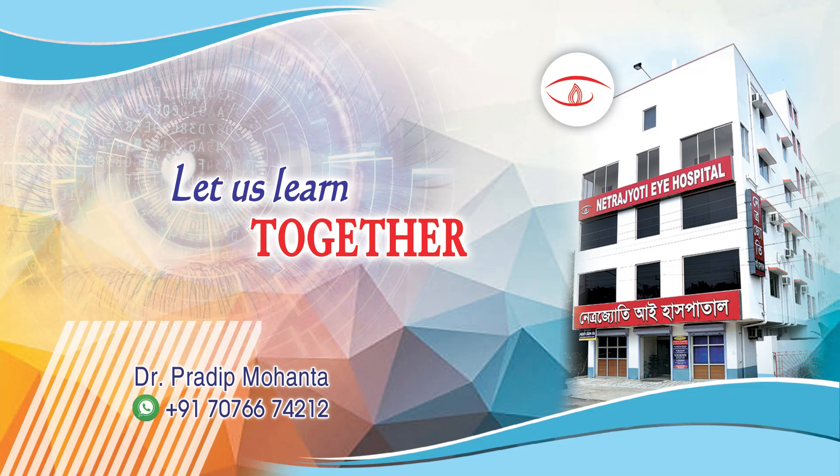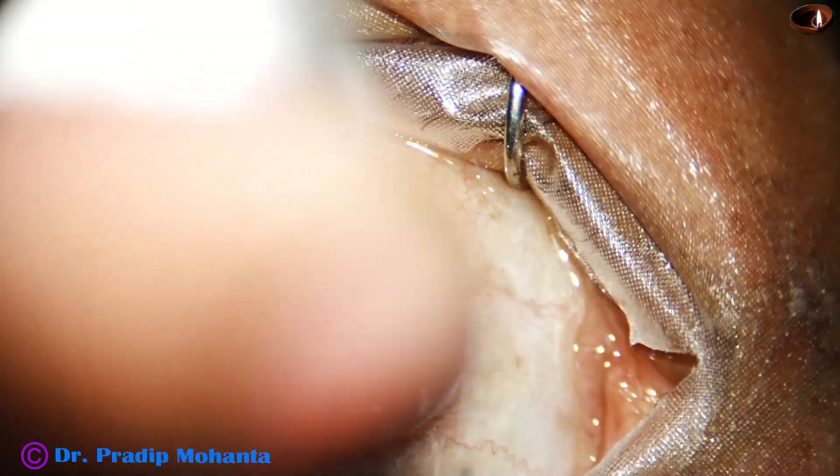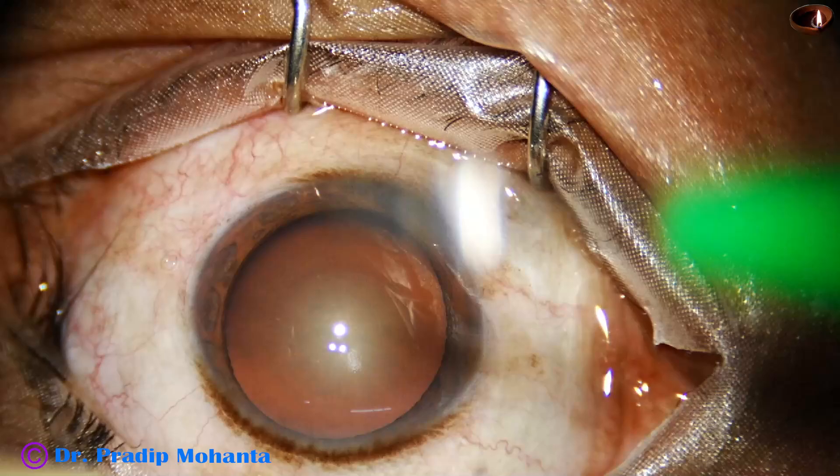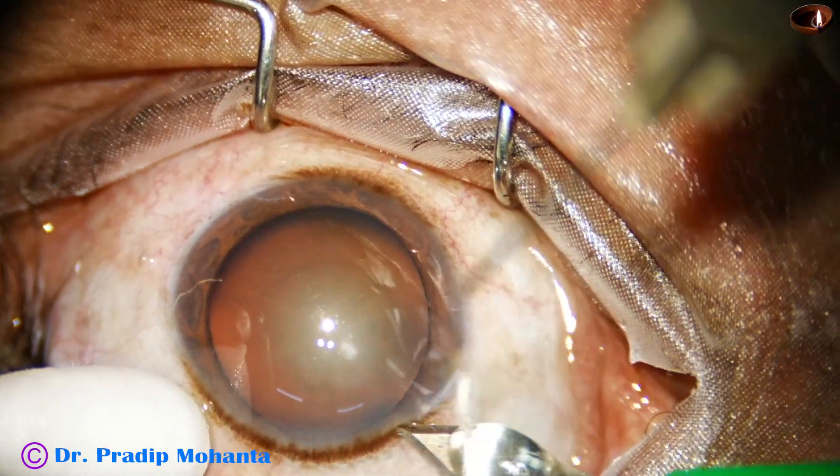Friends, direct chop failed in this case. Let us see how I managed this case. This is a cataract with grade 2 plus nuclear sclerosis. This is a totally unedited surgery.